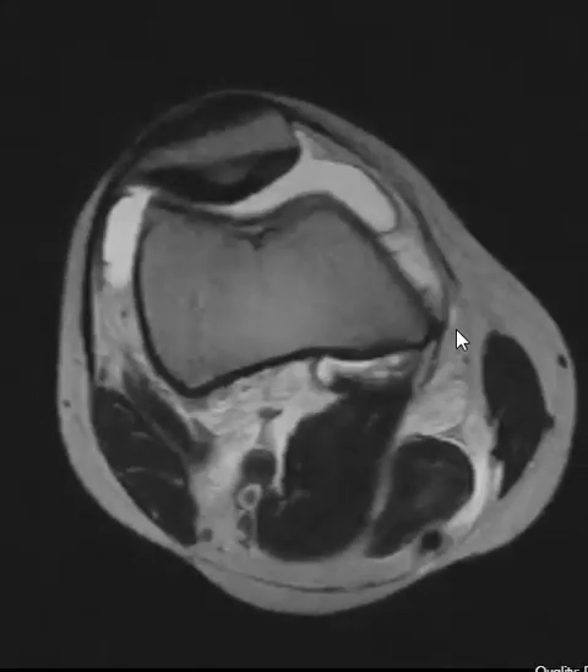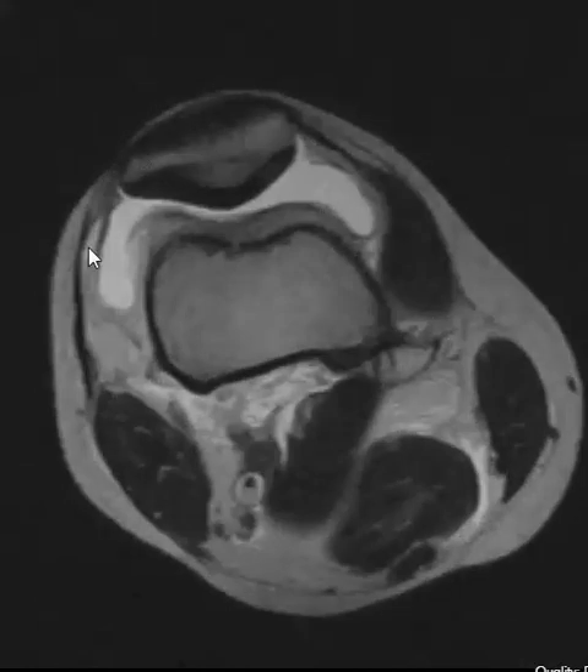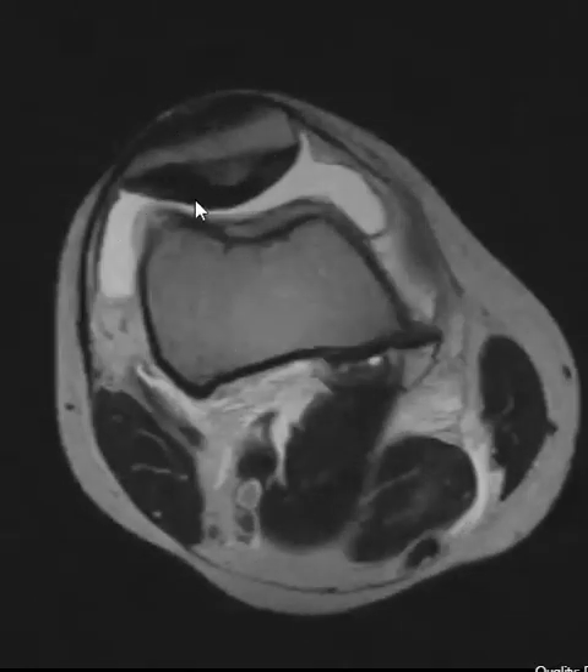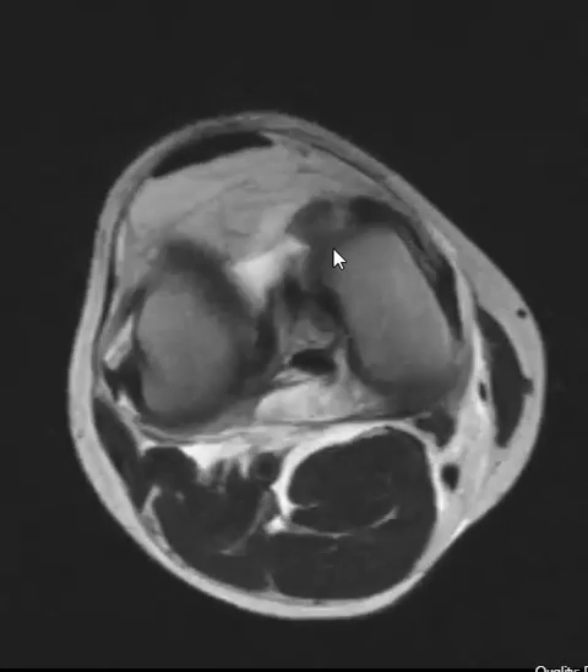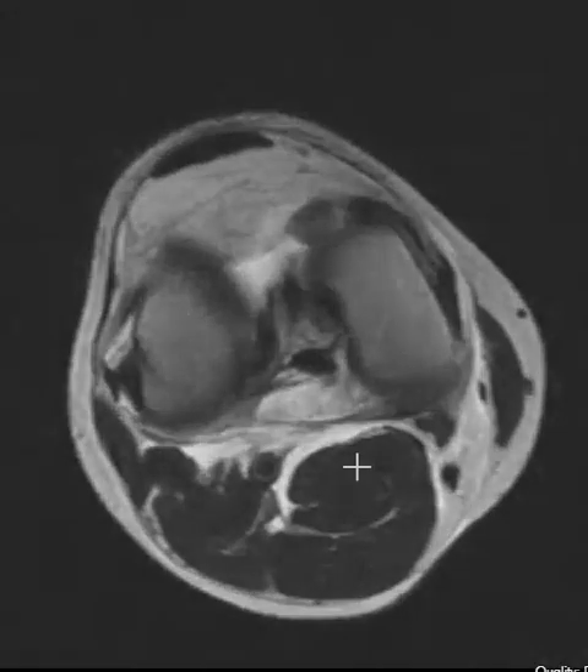He didn't know exactly what happened, but we see he has some fluid in the front of his knee here. Here's his kneecap patella and the femur. We see some fluid moderately distending the anterior compartment. If we look down to the level of the knee joint, about right here, we see that there's also fluid back here.